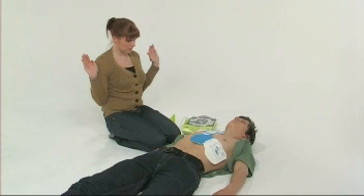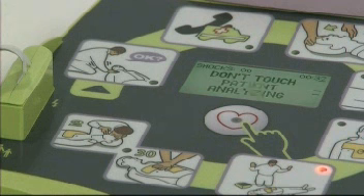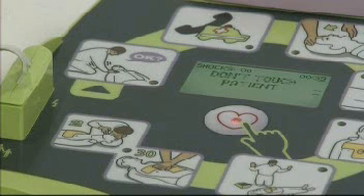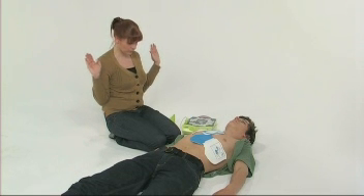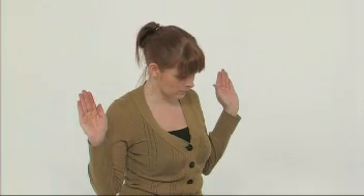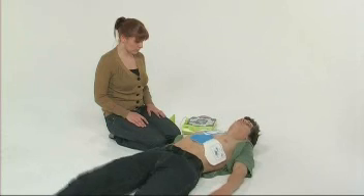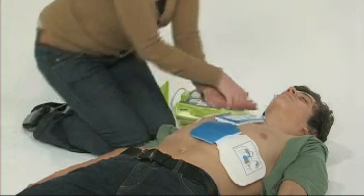The AED Plus will determine whether or not the patient can be treated using defibrillation. If they can, the AED Plus will announce this, then warn you not to touch the patient and to press the flashing shock button. Maintain a safe distance from the patient and ensure that neither you nor anyone else is touching the patient before you press the shock button. The AED Plus will confirm that a shock has been delivered and then advise you to start performing CPR.